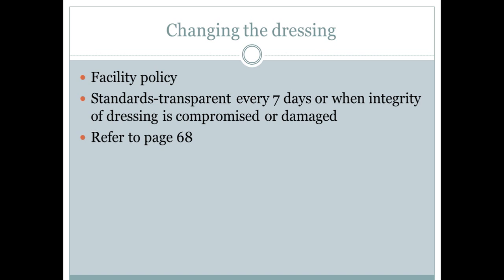Some facilities will have a policy that you change. It used to be, I think the old standard was you actually change your IV site, everything, the catheter and everything every 72 hours, regardless if it's a bad IV. But I think now that evidence has shown that if the IV is still working and the site looks good, just to keep it until it goes bad. So again, always consult with your facility policy on this.